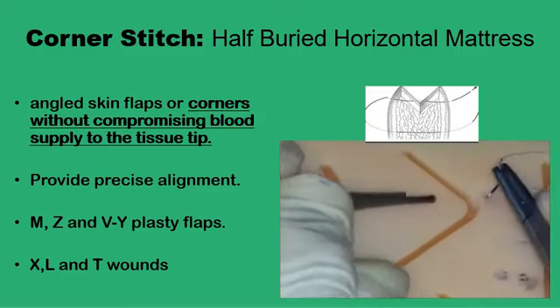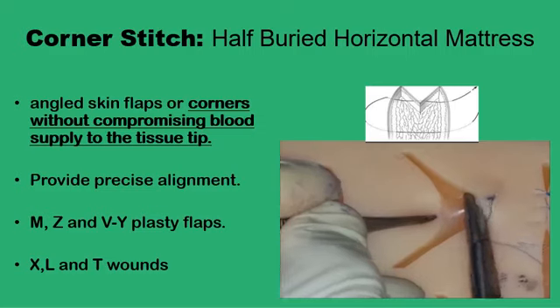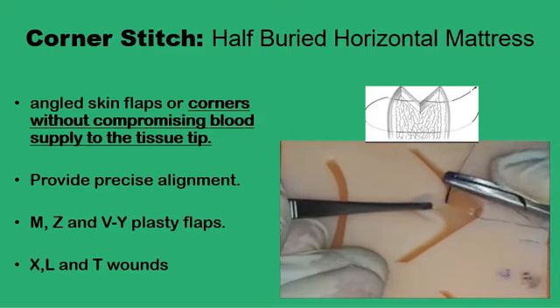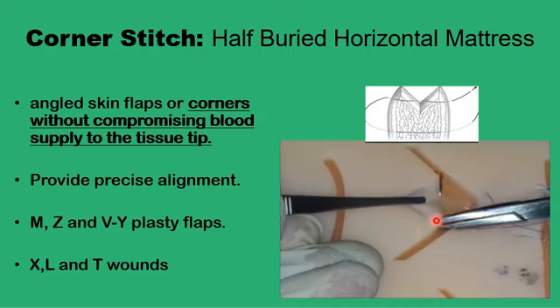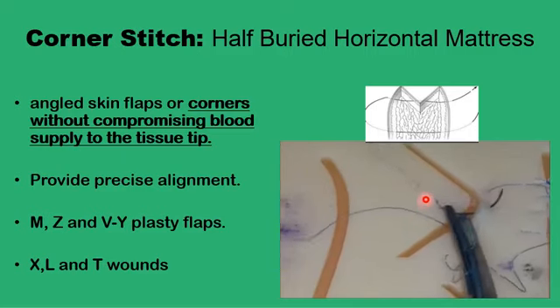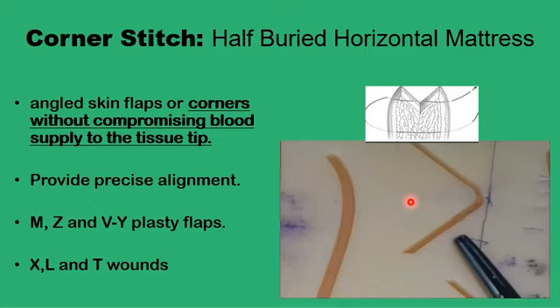And now to another group of sutures developed for other functions. Stitches developed to suture a corner or suture a 3-point or more junctions. The problem with suturing a corner or 3 points is that the blood supply to the angled pieces of skin or flaps would already be compromised. We would want to avoid compromising it any further with any stitches across the skin.